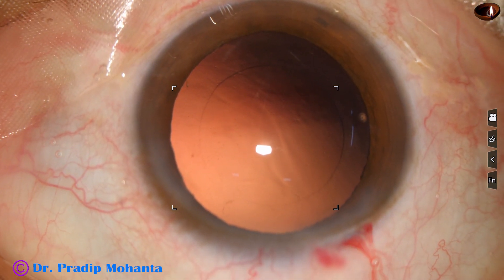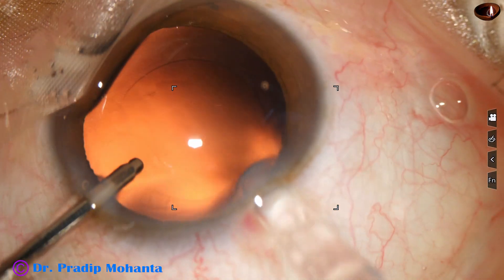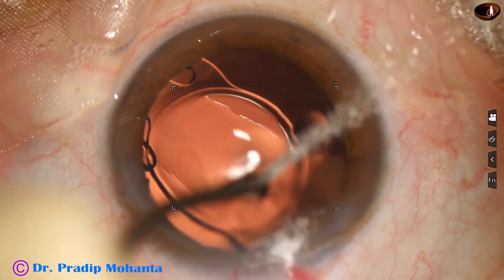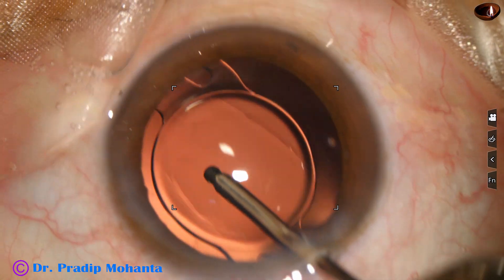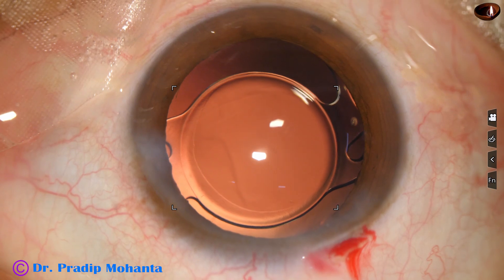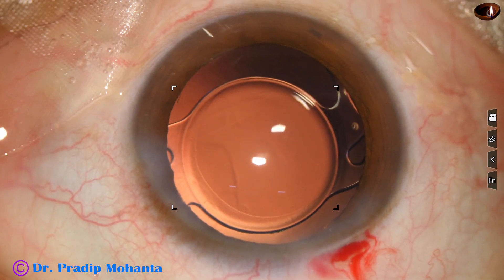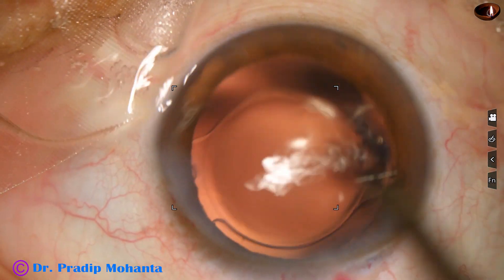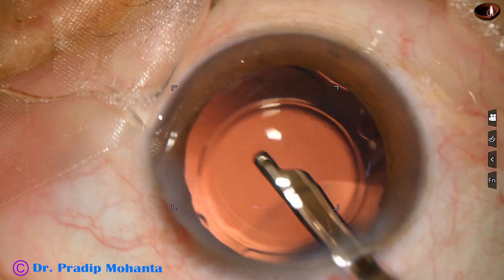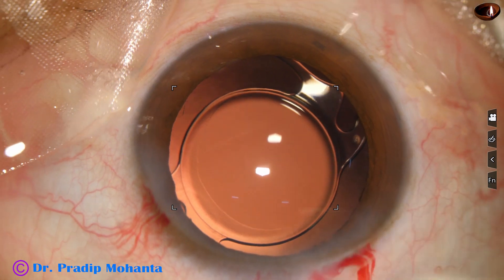Before that, the posterior capsule has been polished a bit. The anterior chamber is kept maintained by the irrigating cannula, the lens is injected, and the irrigating cannula places the lens in position. The side port is closed by stromal hydration — we have only one side port. This is the final lavage; at this time, whatever sticks to the corneal endothelium is also removed. The anterior chamber is nicely formed and the integrity of the wounds is checked.